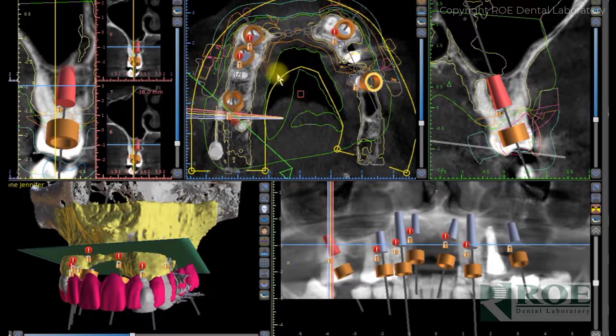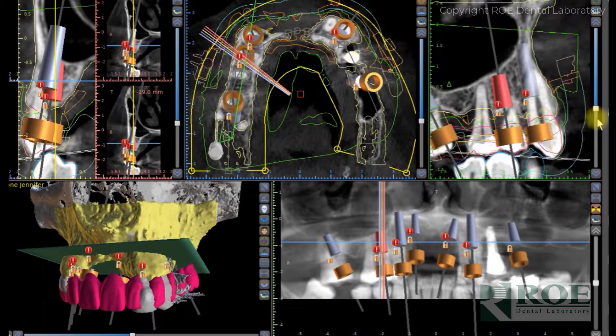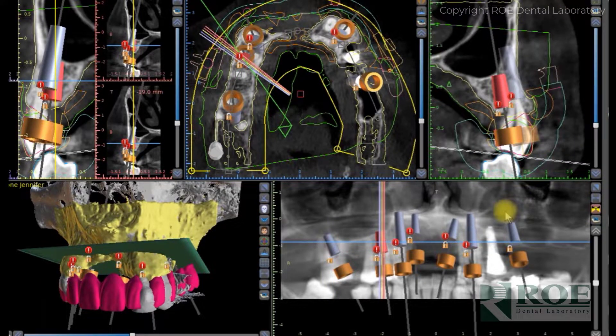If you're familiar with the software, you'll know that these lines diagrammed around the patient are all different layers of STL files brought into the software for analysis. It is a painstakingly extensive process to analyze these cases, and then we go through each implant and manipulate them to make sure they're in the right spot.